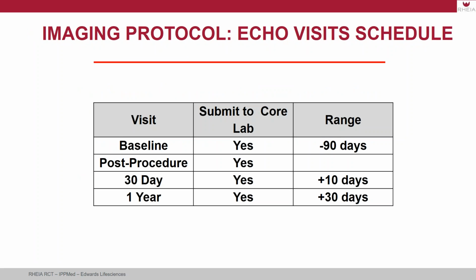So this is the schedule of the echo visits. There is an echo at baseline screening, in the window of 90 days prior to the procedure maximum. Then there is a post-procedure echo that could be done early after the procedure, at the time of discharge or whatever. It's called post-procedure, and it's more for safety purposes.